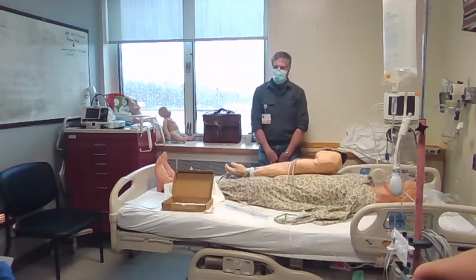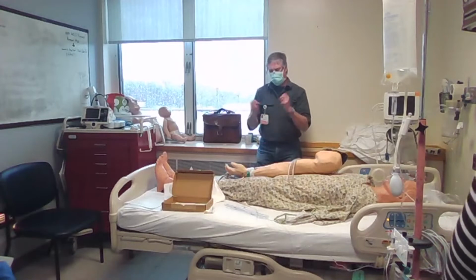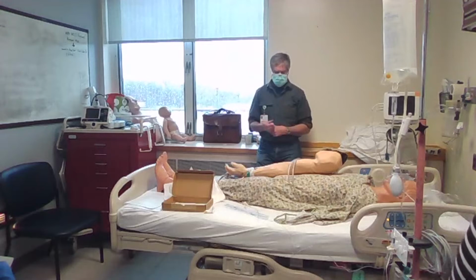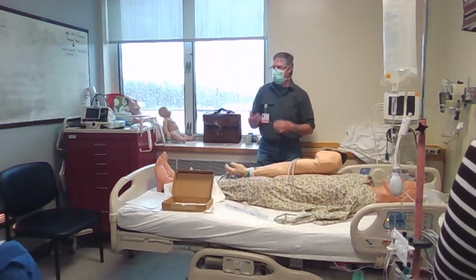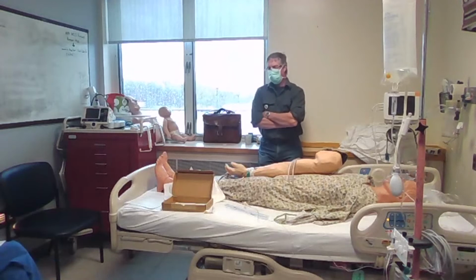I was reading something in your packet there, it said about Raynaud's. Is that something that you have to worry about, realistically? Yeah, people with Raynaud's, they're harder to do. They've just got smaller, more, I guess you could say, angry, sensitive arteries. It's not an eliminating factor. It just makes it harder.